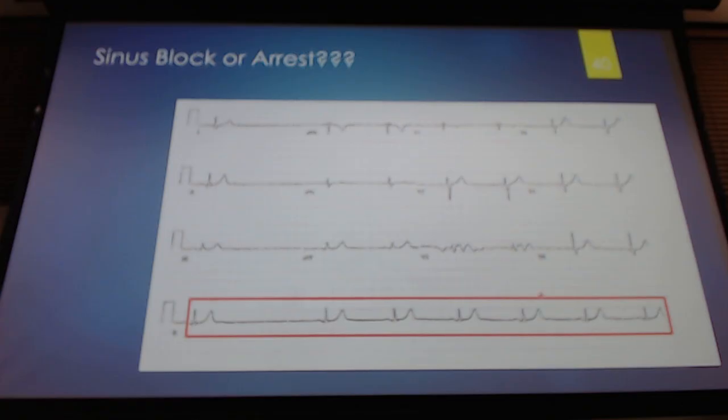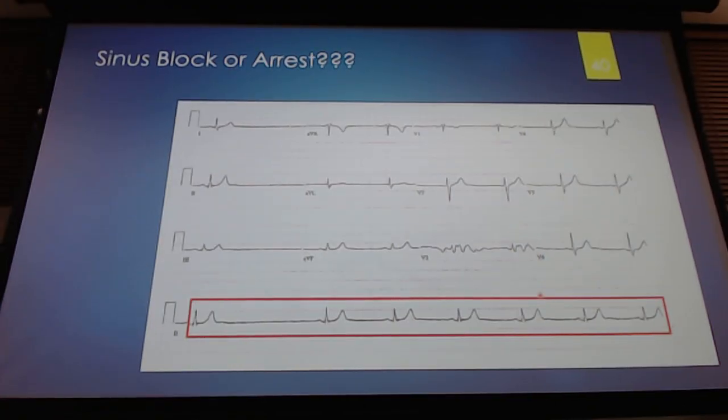And what about this? What does this look like? Sinus block or sinus arrest? Probably a block, right? Because we don't have quite enough space in there. And so it's hard to say because we don't know what happened before here. So if we go backwards though, here to here, we should have something about it here and then there.